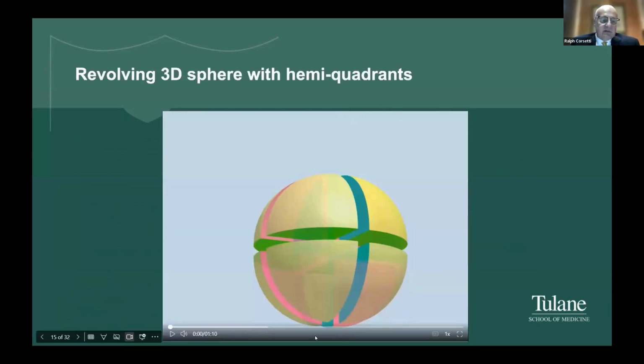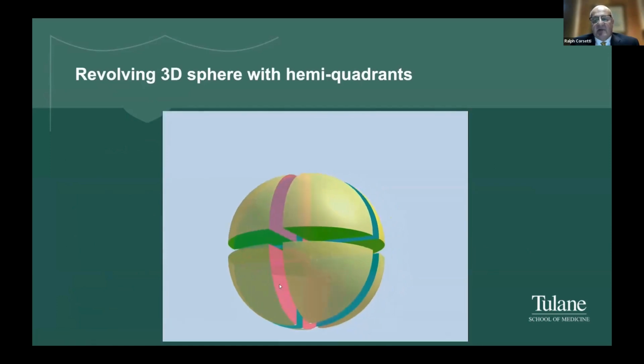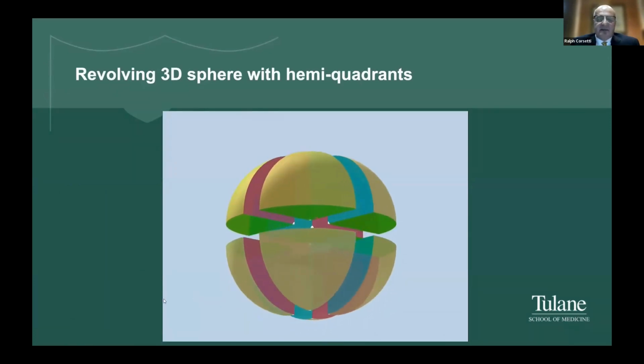Here's a little slide where we like to just show this revolving sphere that CubTech came out for me. So I will shave that about a 1 centimeter thick, 1/8 of a sphere in terms of its surface area.